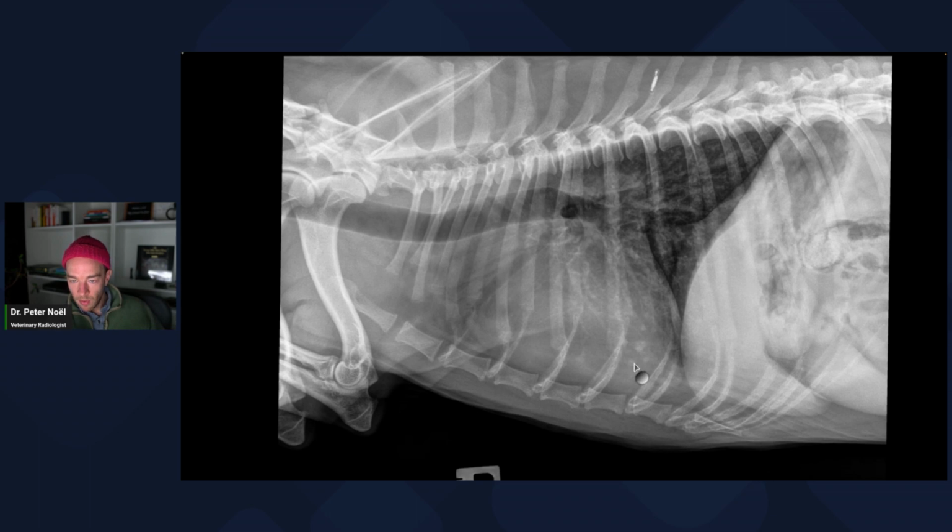It's been my experience, as well as that of a lot of people, that a round soft tissue opaque nodule tends to become conspicuous on radiography only when it hits about 4 millimeters in diameter or larger. So if you have a very small 3 millimeter, 2 millimeter nodule and you're seeing it, it's either an end-on blood vessel or it's mineral, so it's attenuating more X-rays, more photons, than the soft tissue nodule.